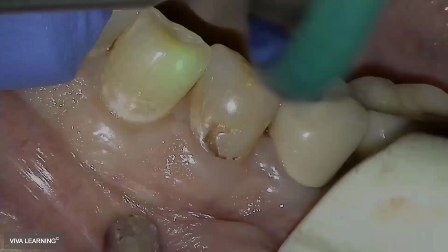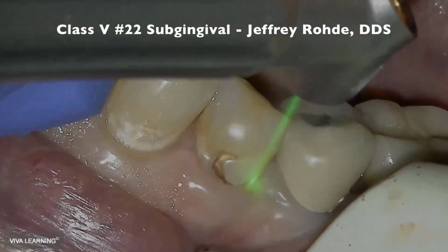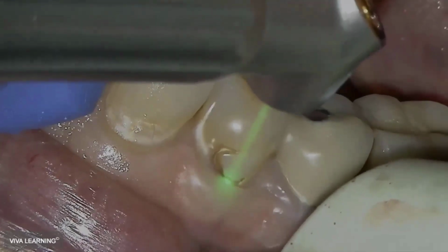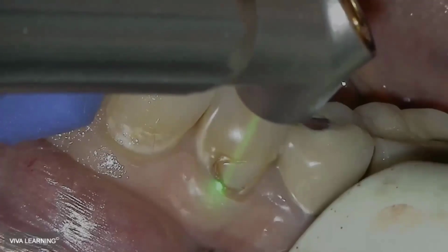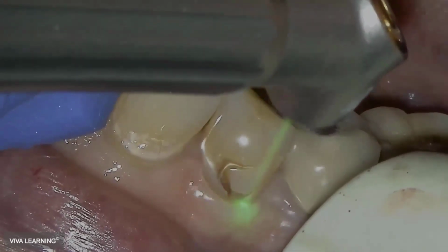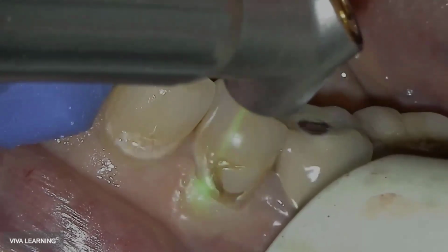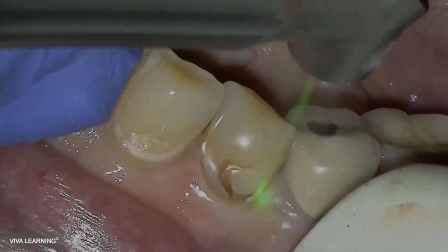So what you'll see is the first thing I'll do is actually go in there and remove some of the soft tissue there as we come across. And it's just kind of resculpting that. Now, definitely, one of the things we cover in training too is to kind of be aware of how much attached tissue you have left. There's a different technique if it's thin, so you do want to pay attention to where the keratinized tissue is.